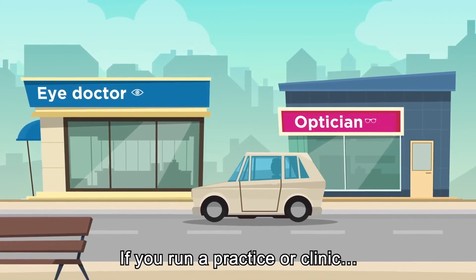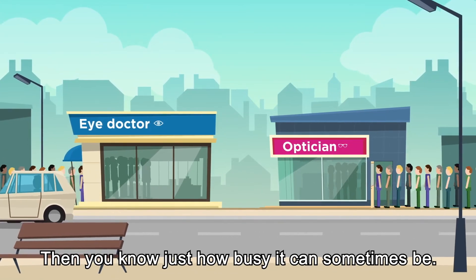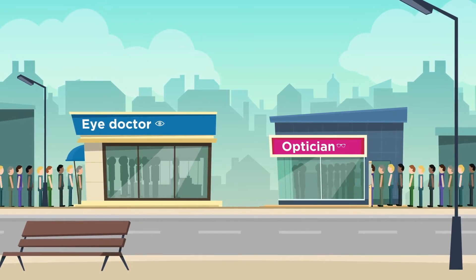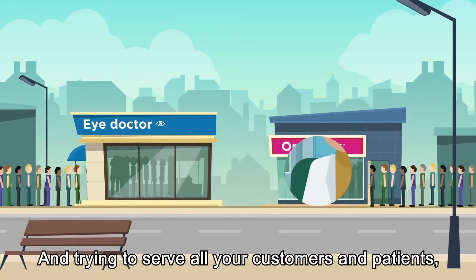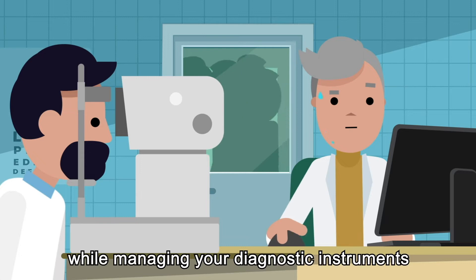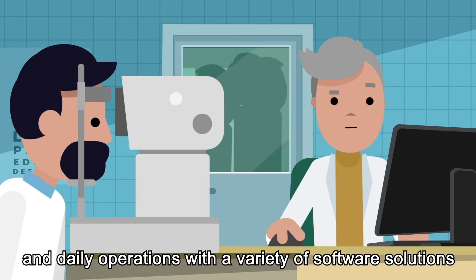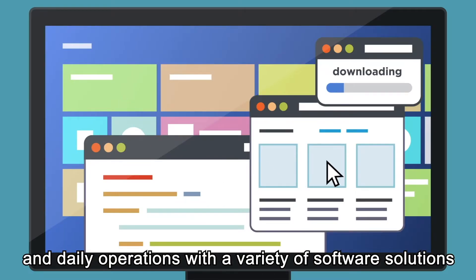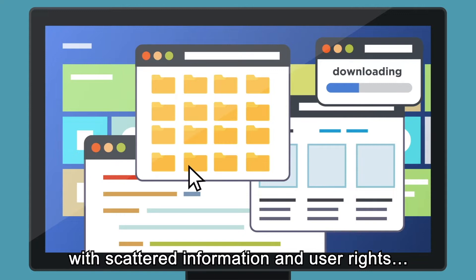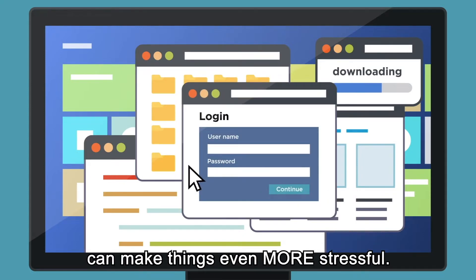If you run a practice or clinic, then you know just how busy it can sometimes be. Trying to serve all your customers and patients while managing your diagnostic instruments and daily operations with a variety of software solutions with scattered information and user rights can make things even more stressful.